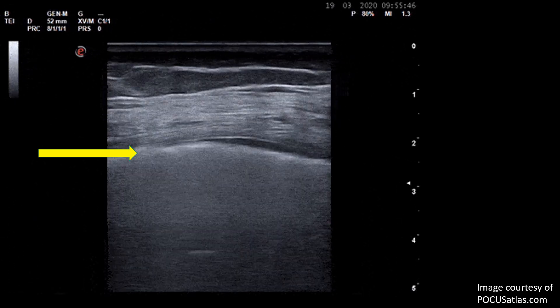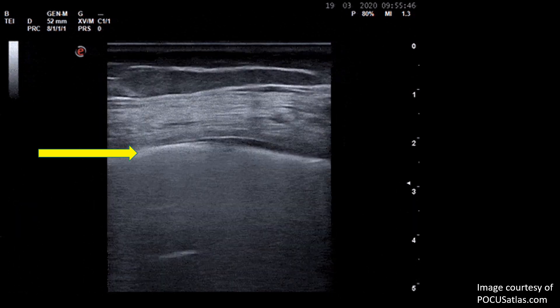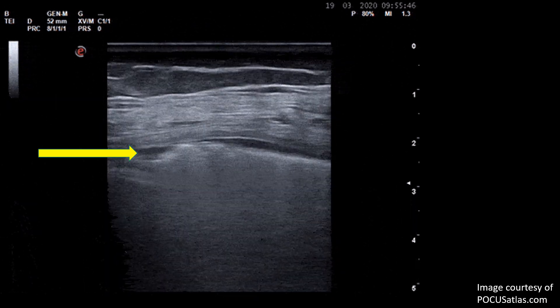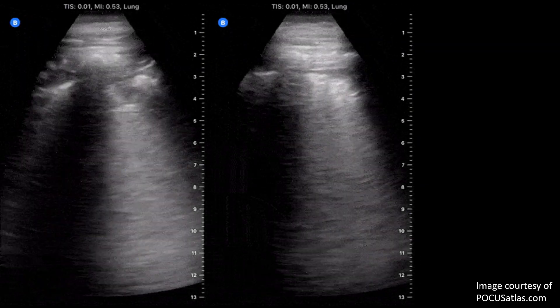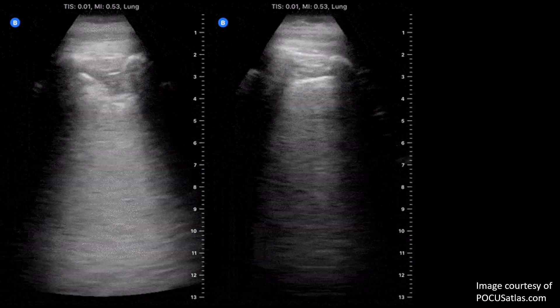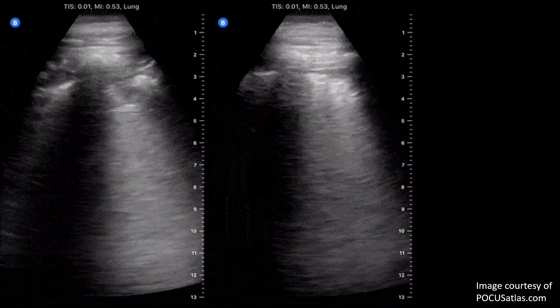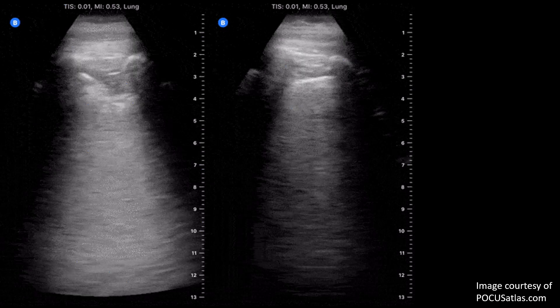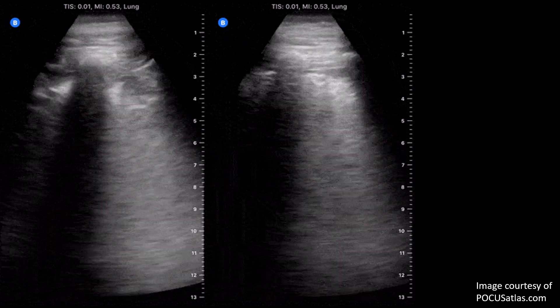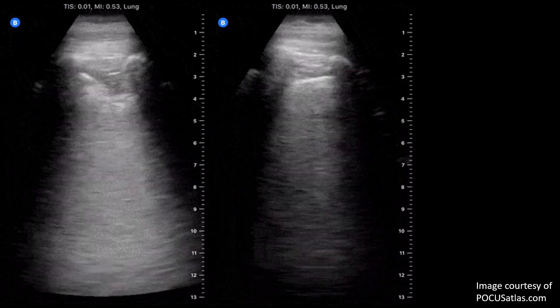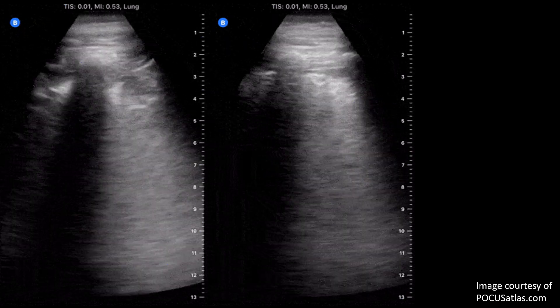Here is another ultrasound of a COVID-positive patient showing an irregular pleural line and subpleural consolidation marked with the yellow arrow. There are also multiple B-lines. Here is another example of a patient with confirmed COVID-19. This is on day nine of their symptoms, and you can see a view of the left lower and left upper lobes. The patient has multiple findings of viral pneumonia, including a thickened pleural line, confluent B-lines, and subpleural consolidations.